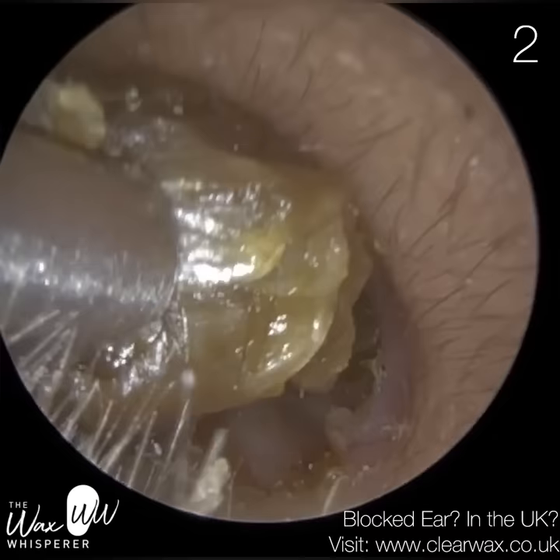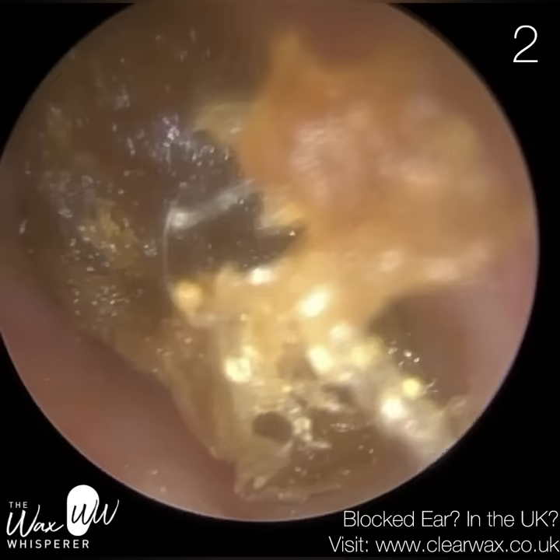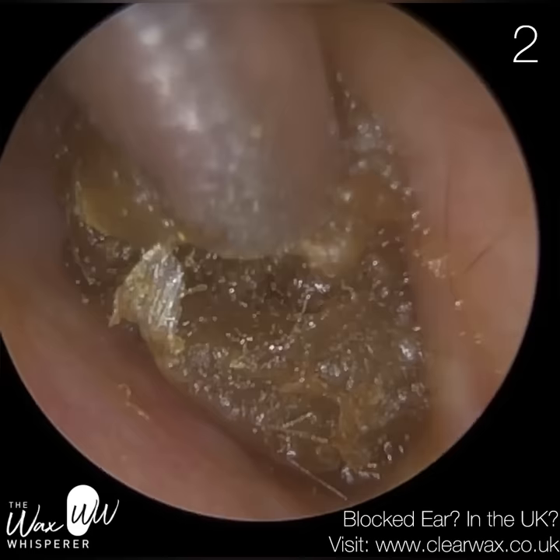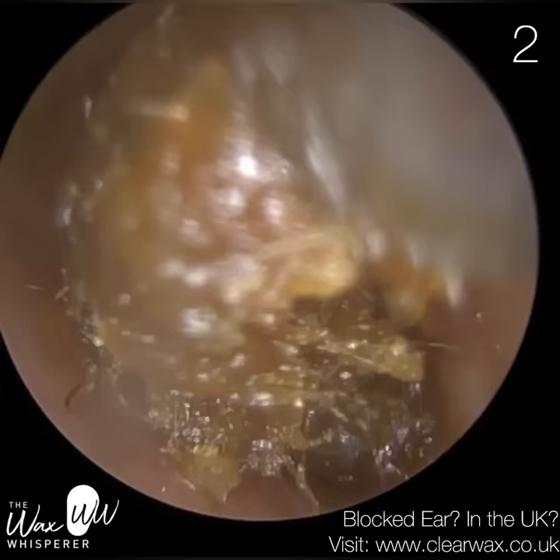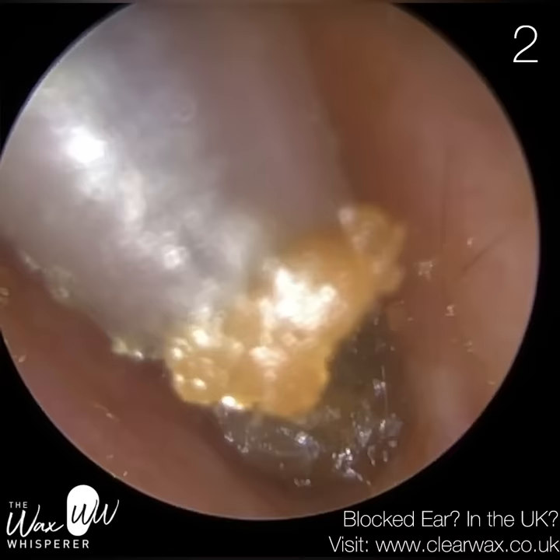The outer third of the ear canal — the cartilaginous portion — is where the hairs are found. On the bony part, the inner two-thirds, you shouldn't really find any hairs protruding out from the ear canal itself. That's because the skin that lines the bony part of the ear canal only contains the outermost layer of skin, which is the epidermis layer. In order for hair strands to exist, you need hair follicles, which originate within the dermis layer — the middle layer. The bony part of the ear canal doesn't have the dermis layer of skin.